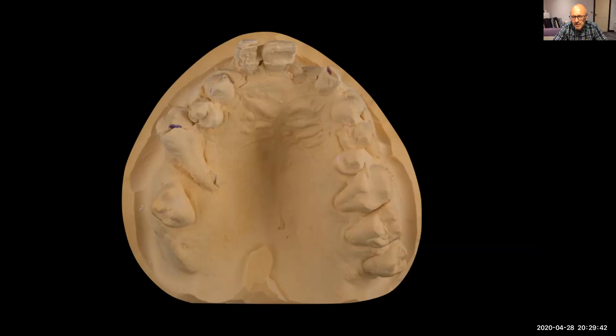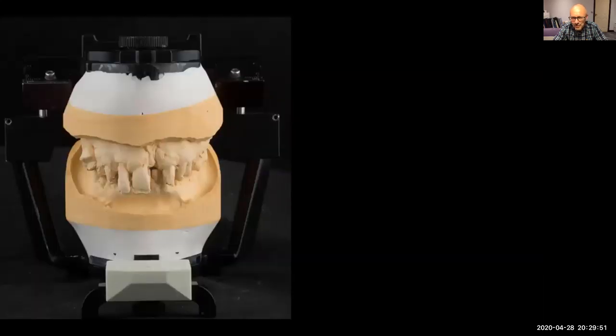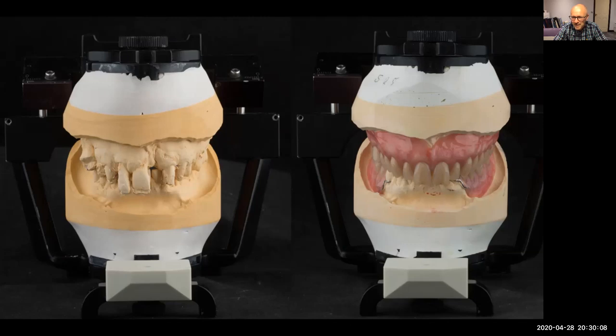And this is the cast that we can pour from that. It's got everything on it, a great sulcus. We then mount that in intercuspal position using our bite, Futar D bite. And then we look at this and we think, where are we going to put the teeth? Which teeth are in the right place, which aren't? And we use photographs to do this, and it's great. So Rowan and I just line things up. We put them back where they should be.